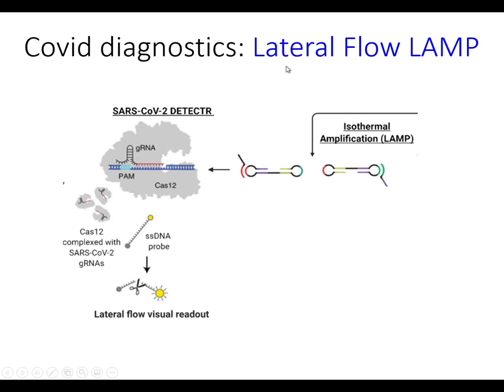There is another type of lateral flow assay available, and this is through a molecular based technique rather than a protein based technique. So this depends upon first amplification of the viral genome using isothermal loop mediated amplification, LAMP, which I'll talk about a little bit later.